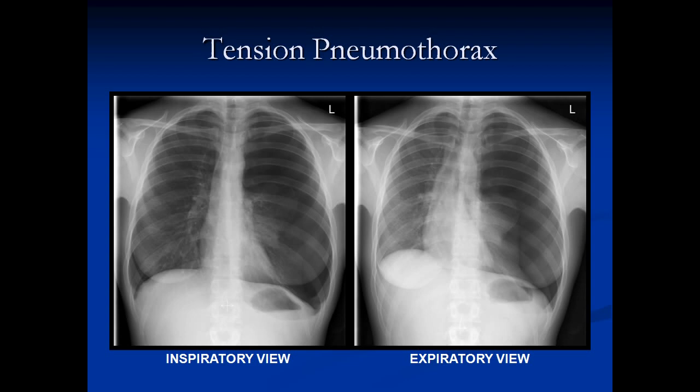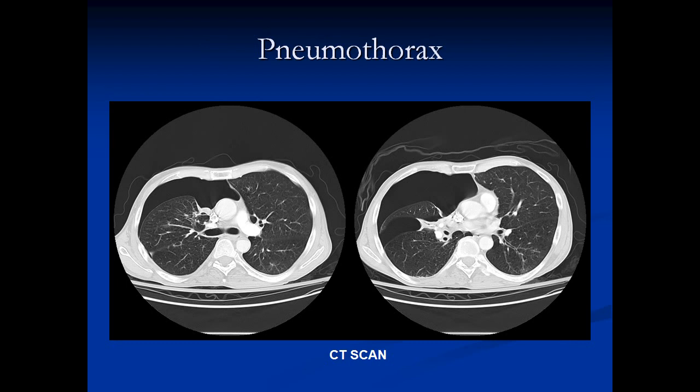In the next study, we have an inspiratory view on the left and an expiratory view on the right. With both expiration and inspiration, the mediastinum has shifted way over towards the right side. This implies there is tension in the left pneumothorax, and this person needs a chest tube fairly urgently. The white structure in the center of the left hemithorax is the collapsed lung. On CT scan, air always rises — so if the patient is lying down, you'll see the pneumothorax against the anterior chest wall; if the patient is standing up, you'll see it in the apex.